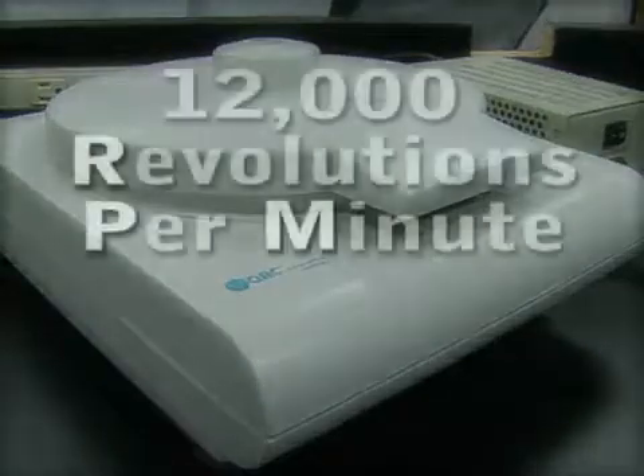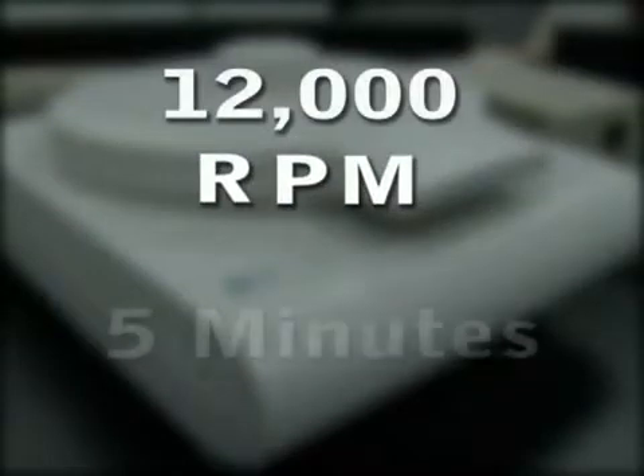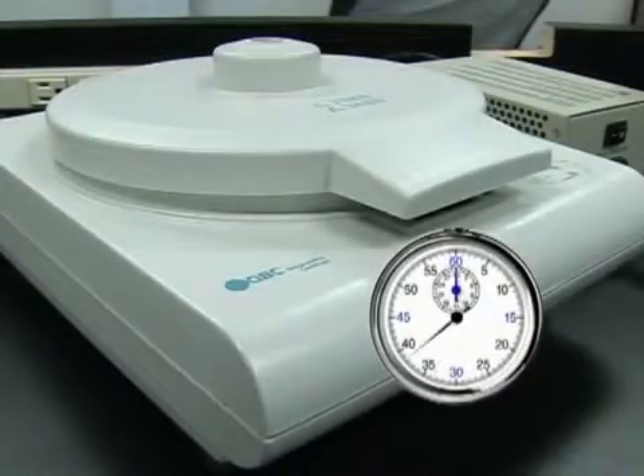The centrifuge will operate at 12,000 revolutions per minute, or RPMs, for 5 minutes. Regulations require that the RPMs and timer be checked every 6 months. Checking the timer is as simple as running the centrifuge and comparing it with an external timer for the full 5 minutes.